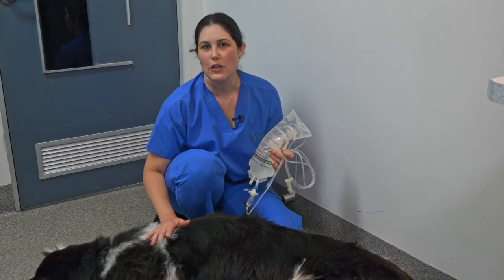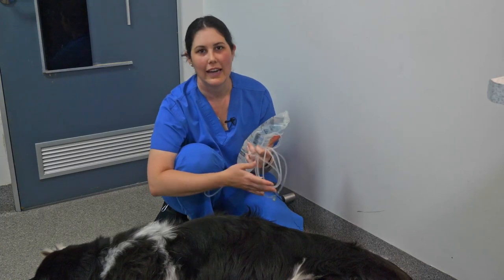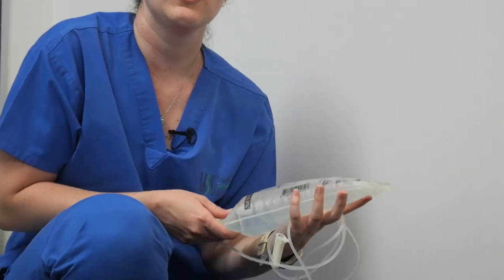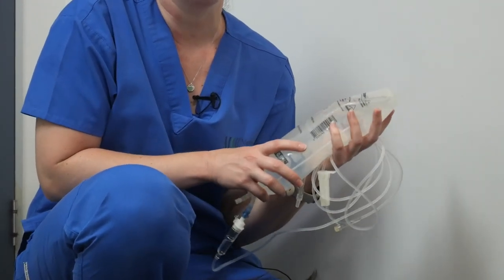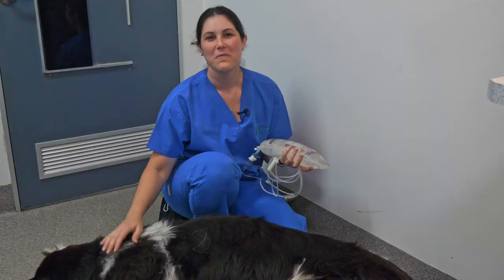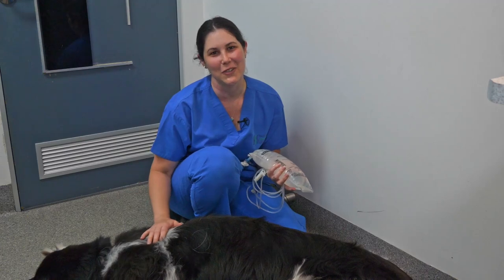For every new bag of fluids needed for your pet's subcutaneous fluids at home, your vet will give you a new bag and a new giving set as well. To store your fluids, keep them at room temperature out of direct sunlight. If you have not used the full bag within one week, we advise going back to your vet and getting a new bag. If you have any further questions, please don't hesitate to contact your team at your local Veterinary Specialist Services.